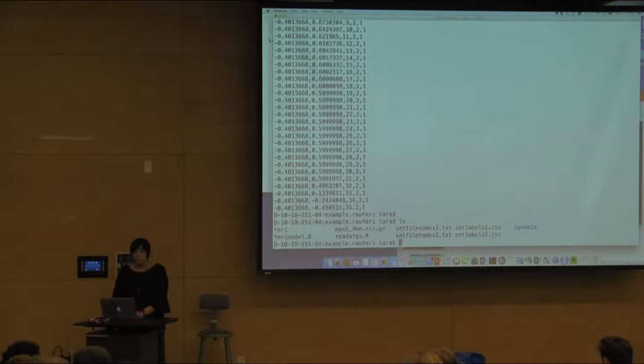Sorry, can you explain again what the high and low columns are? It's just a simulated experiment. Those are your 2 explanatory variables. They've just been convolved, exactly like we had EV1, EV2 with the NBAC task. This is some random high and low stimulus or something like low conditions.